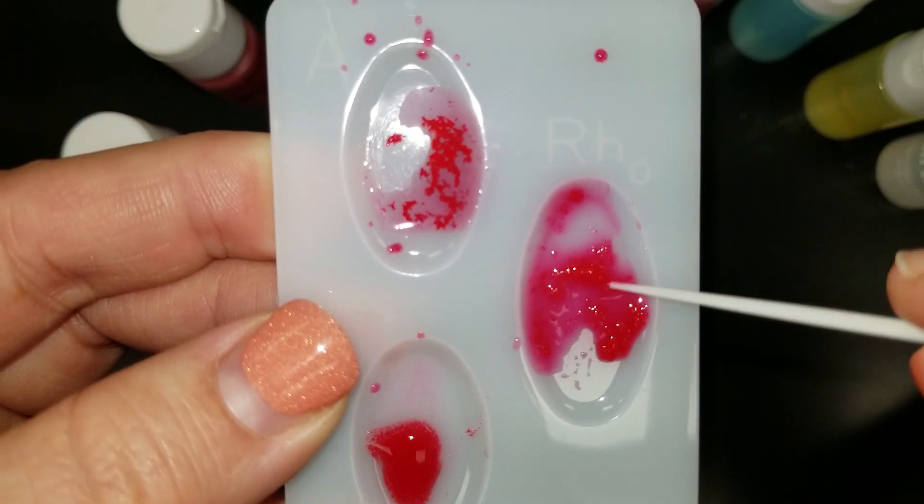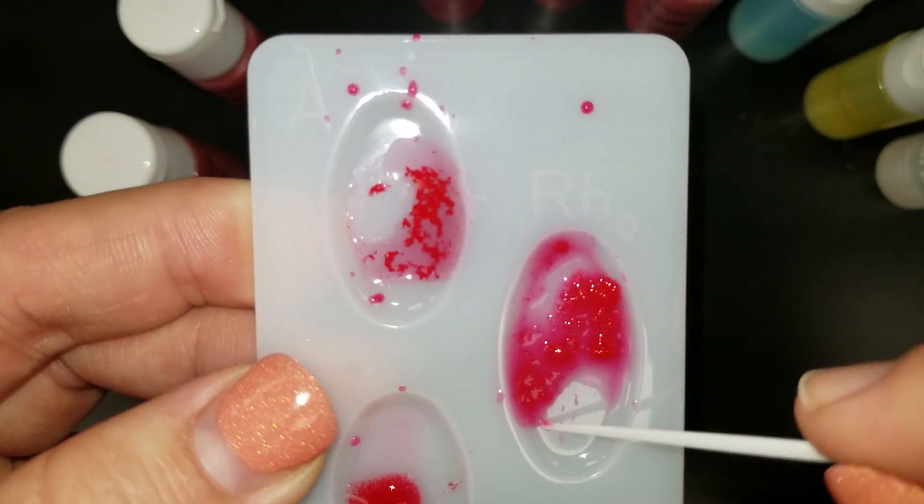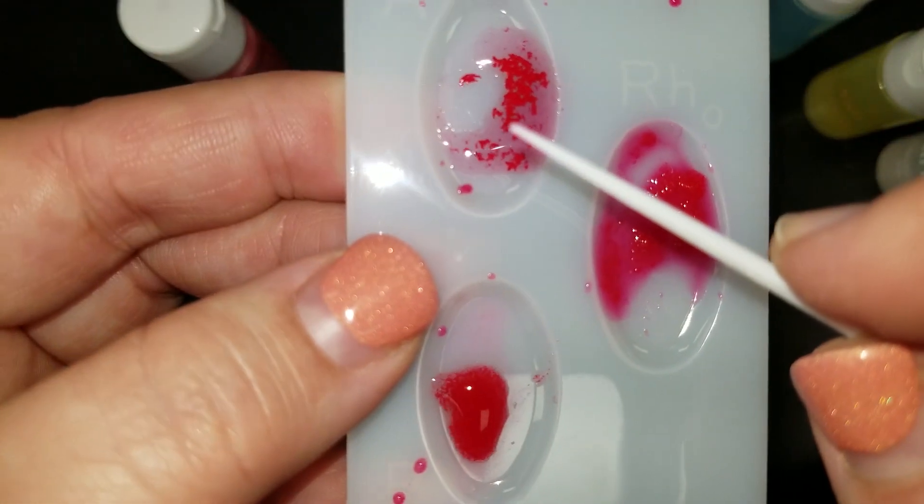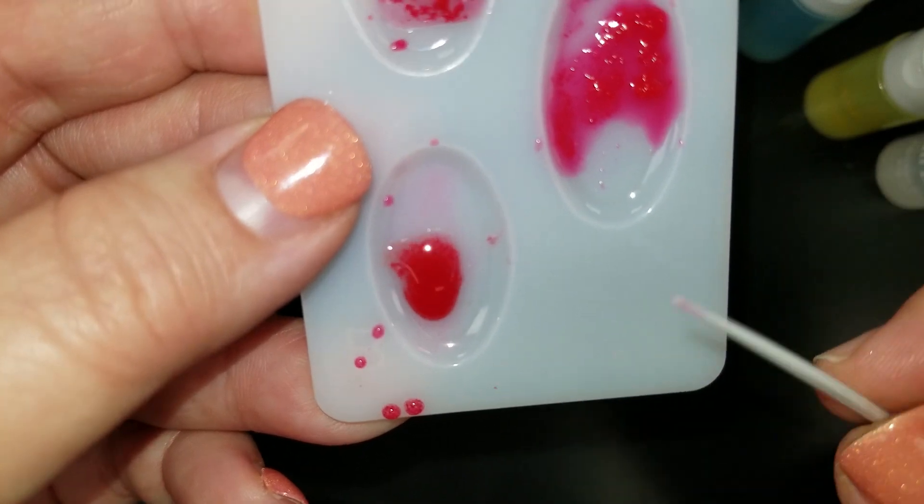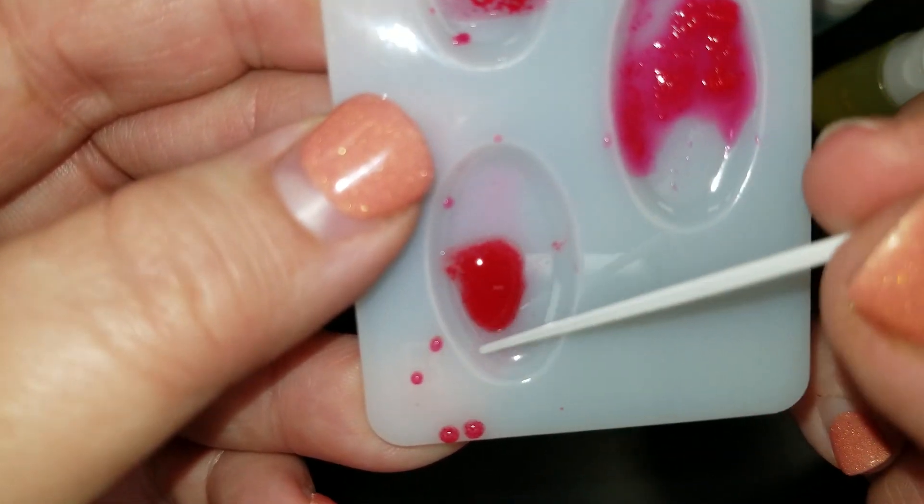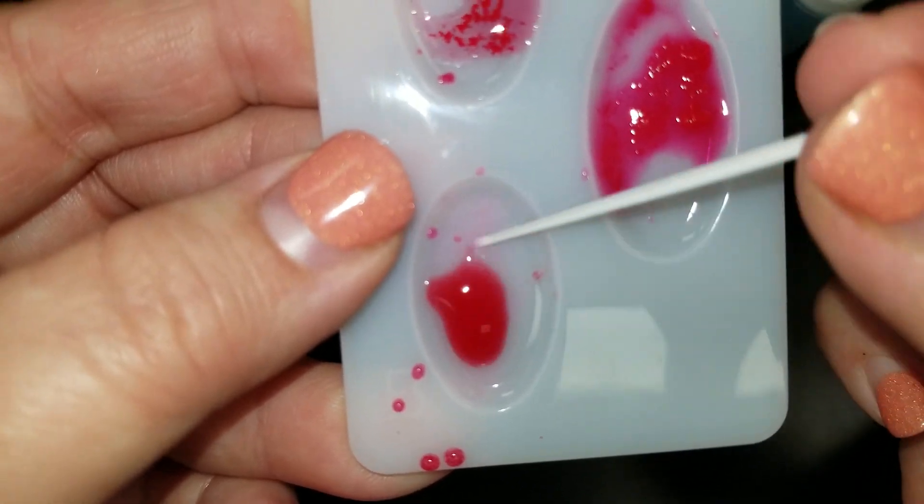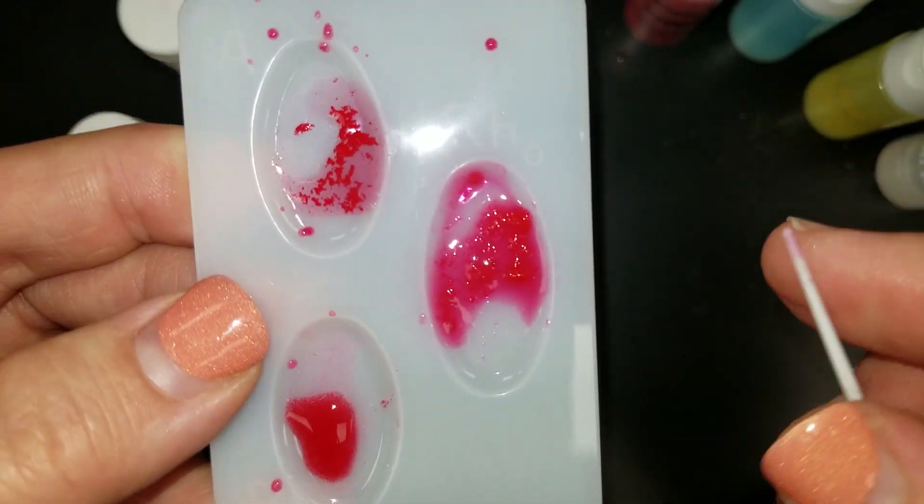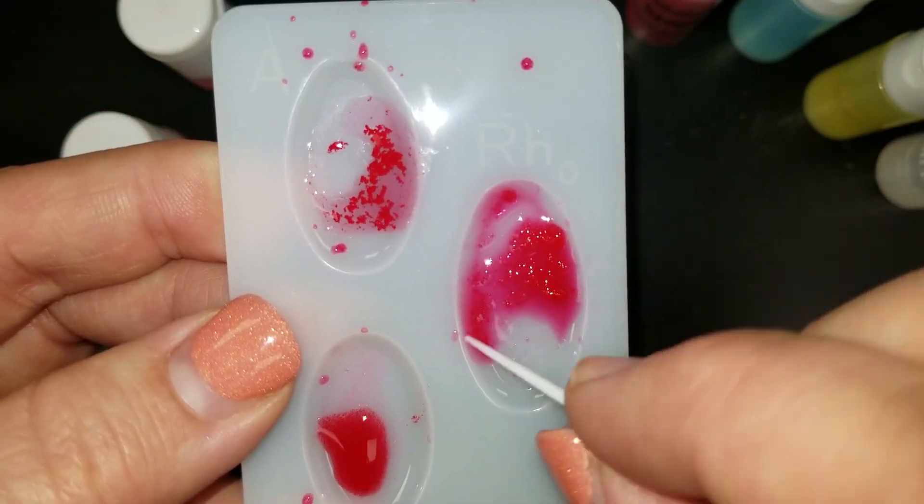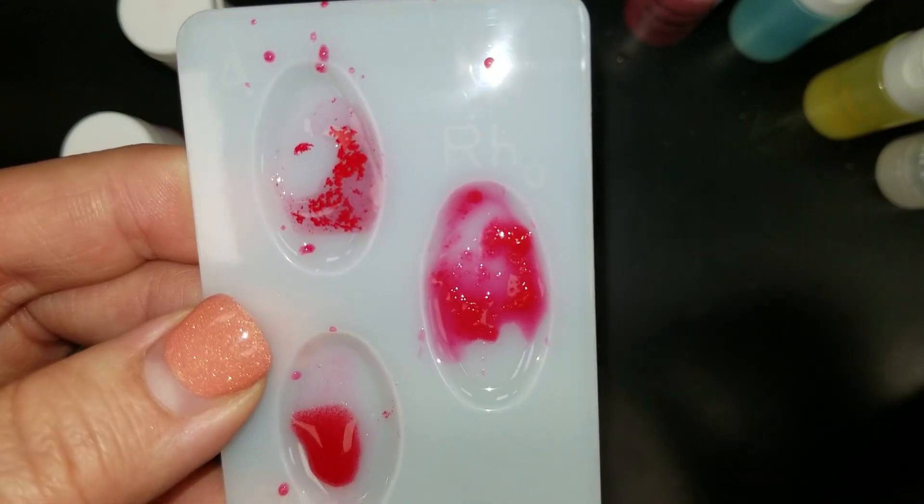So Andrea is actually positive for all three of these antigens. She has the A antigen. She has the B antigen, and again, it's kind of hard to see that on this video screen, but there are little red globules inside this larger red dot, which is a positive for B. And then for our Rh, it's just become like a little melted jello. And that's a positive for Rh.